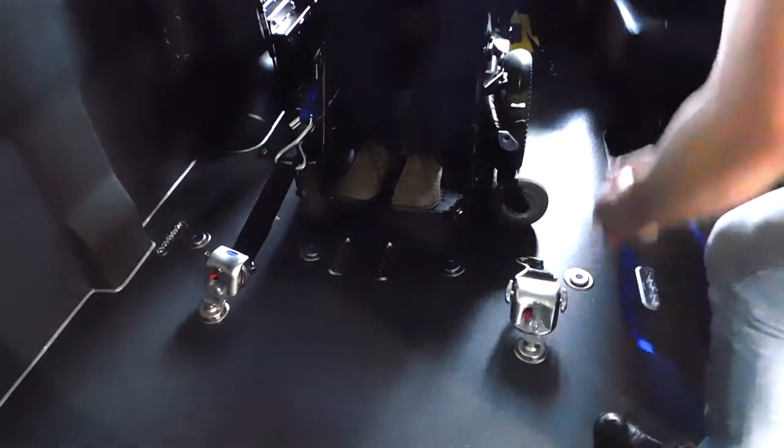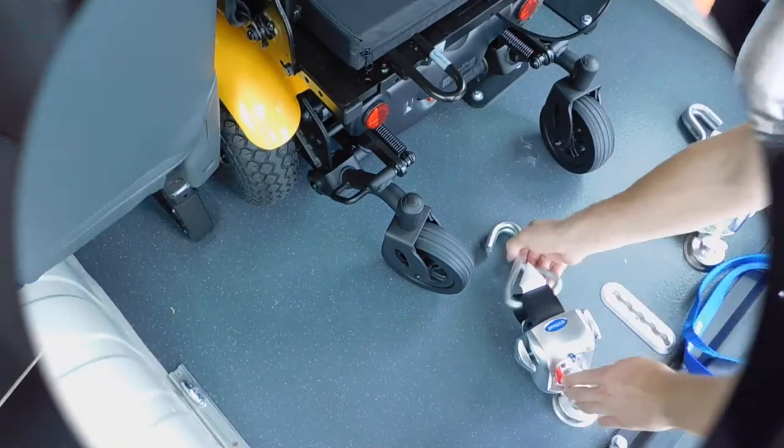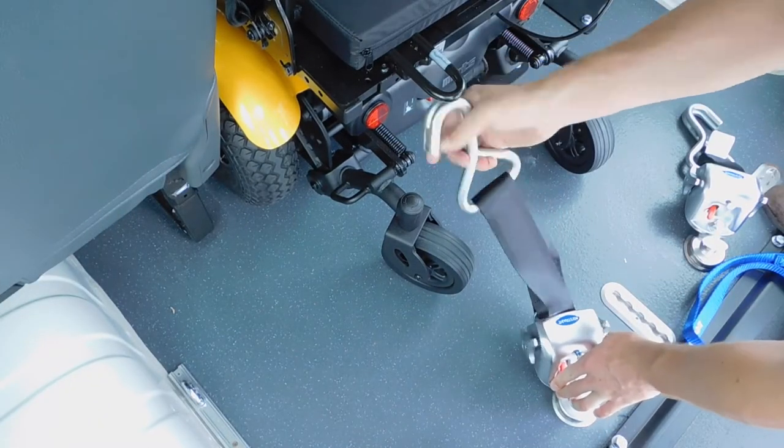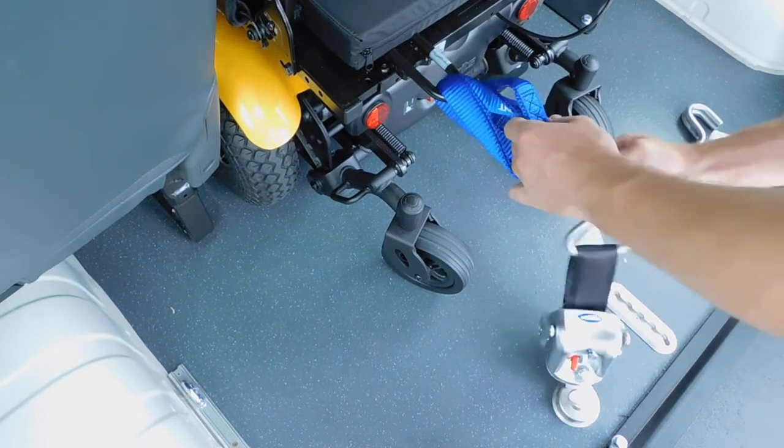If you require the blue loop belt to attach the restraint, only one is required at the front of the chair. At the rear of the chair you must apply two loop belts if you are unable to attach the double hook to the designated anchor point.